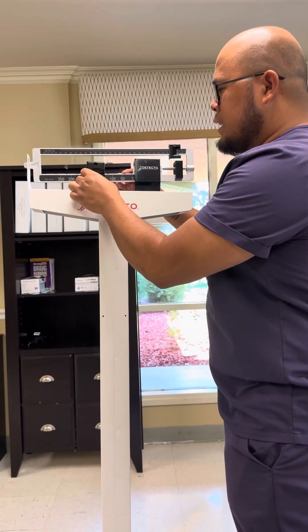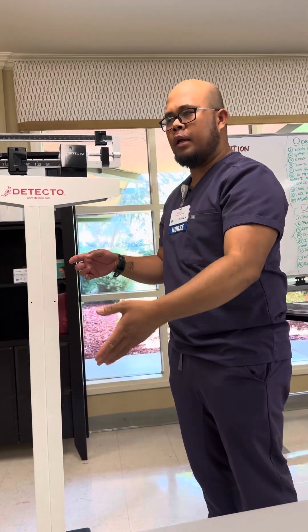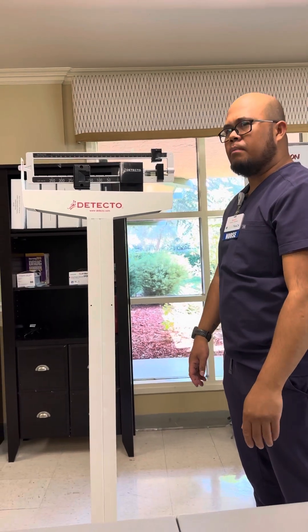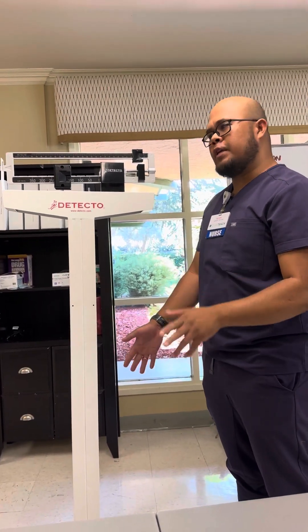If I were you on your regional exam, try to estimate your patient's weight or your partner's weight. For example, Diana, you would be below 100, so try to estimate. Probably me, I'm more than 150, so put it on 150.